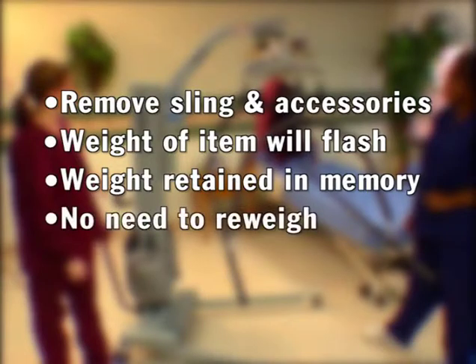Thus, if weighing more than one resident, you do not have to re-weigh that accessory unless you choose a different size or type.